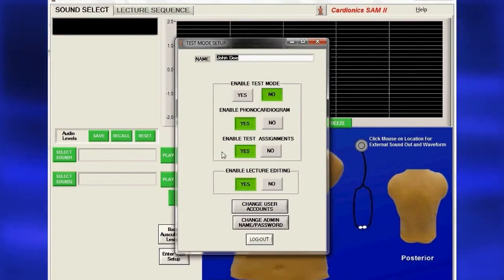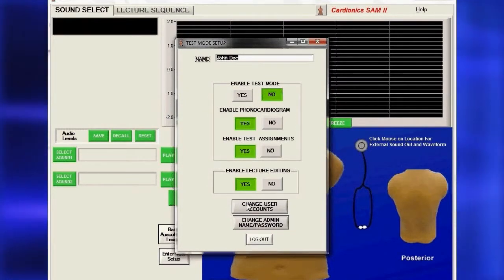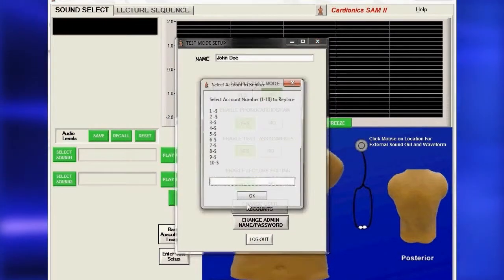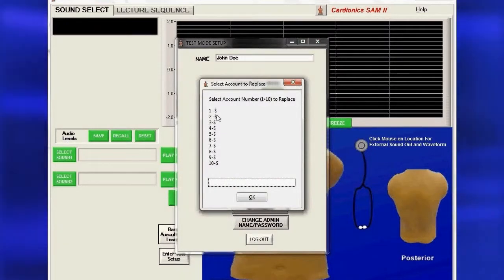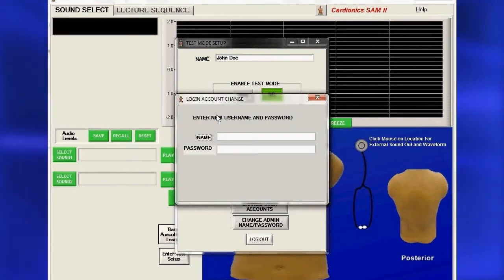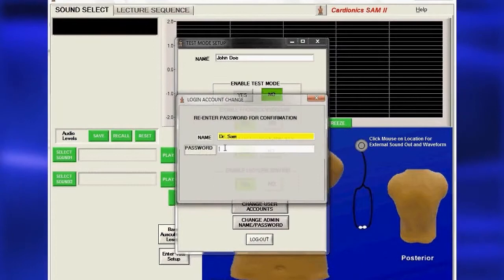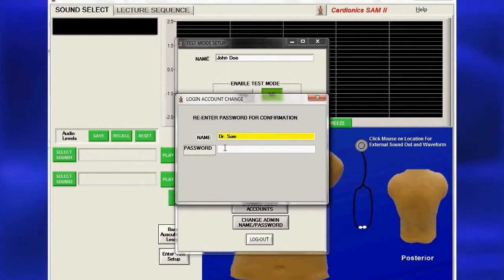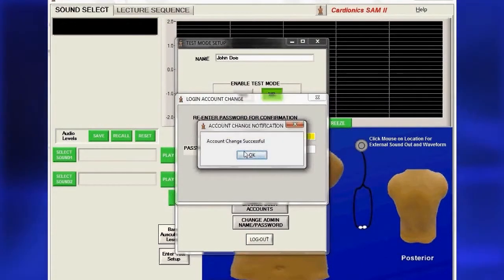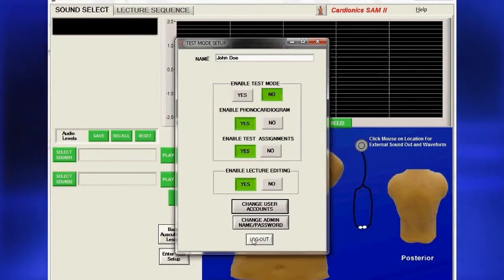To add an instructor, click Change User Accounts, and the Select Account page will appear. From the list of instructors, enter the next available number and press Enter. A dialog will appear for entering the new name and password. You must confirm the password by entering it twice. The new instructor's name will now appear in the list.